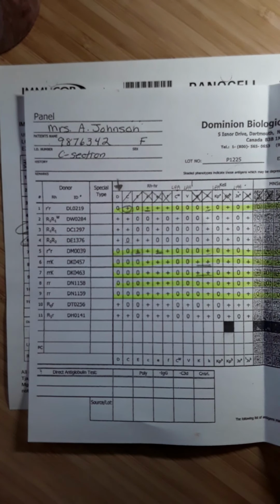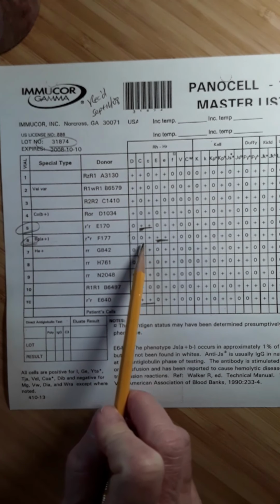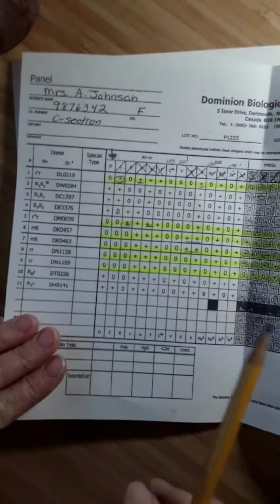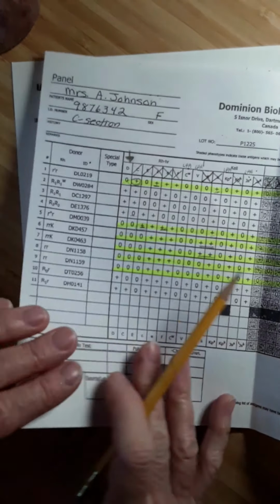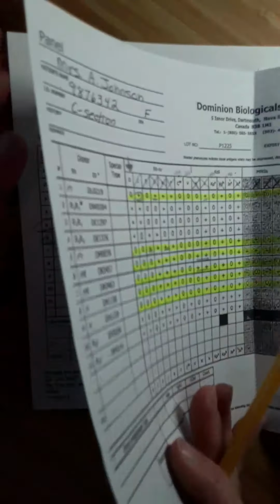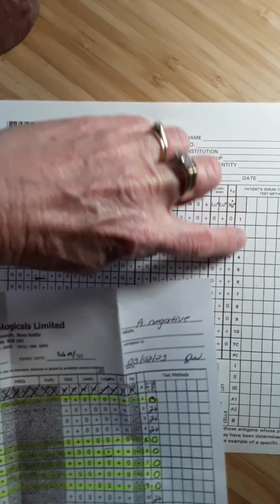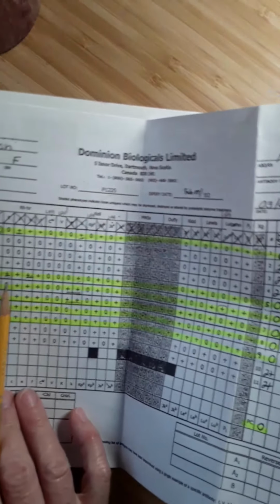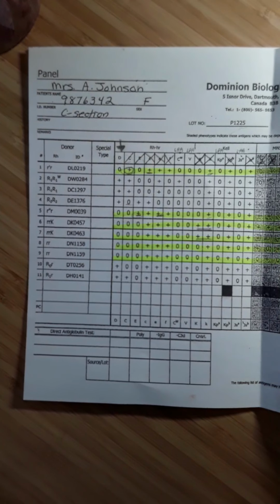So luckily we have this little caveat to the rule, and the additional 2 cells that I would set up would be from this panel, cells 5 and 6. If when I set them up they did not react, I would go back to my original panel and put a slash across big C and big E. And I would staple this panel sheet completed, filled out completely with the patient's demographics and everything, the results listed, and I would staple it to this panel sheet because this is all the work that's been done on Mrs. Johnson. So I feel pretty happy that my patient's plasma only contains an anti-big D.